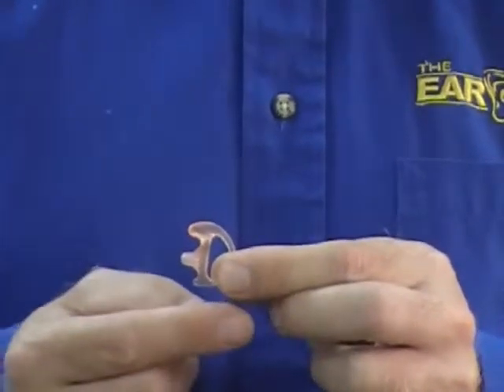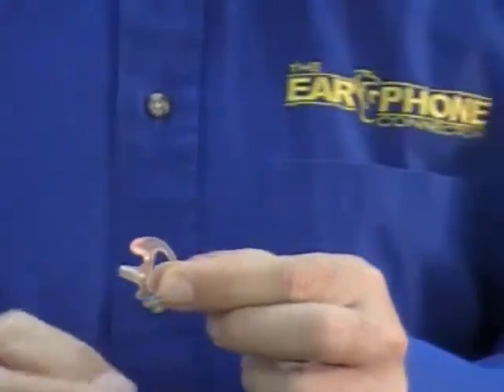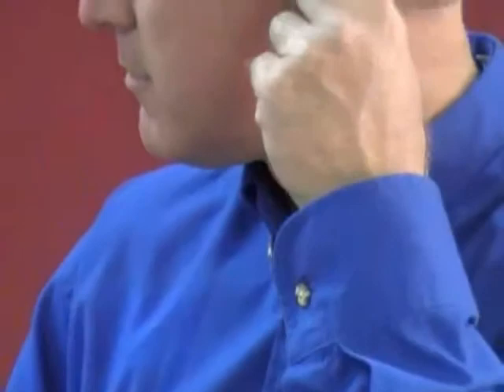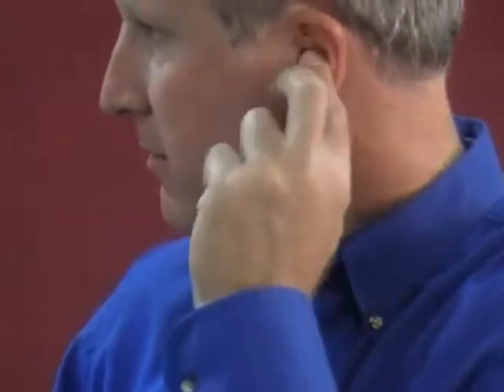To show you on my ear how this fits — this is going to be for the left side. You take the ear mold and massage it into the ear, and even the ball on top should go behind the lip on the ear. That is the proper way that the ear mold should fit.